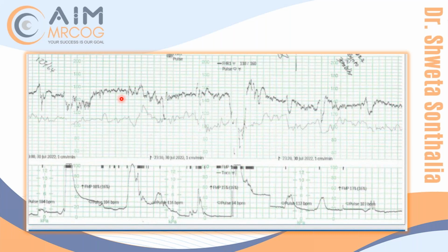Can you fit these decelerations into early? Because they start with contraction and recover along with contraction. Okay, very good. Now you tell me, how many decelerations can you see in the picture? 1, 2, 3, 4, 5, very good. 6, even 7, this is also a deceleration. 1, 2, 3 here, 4, 5, 6, 7, 8.